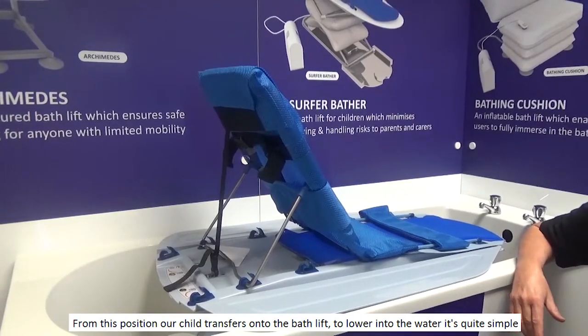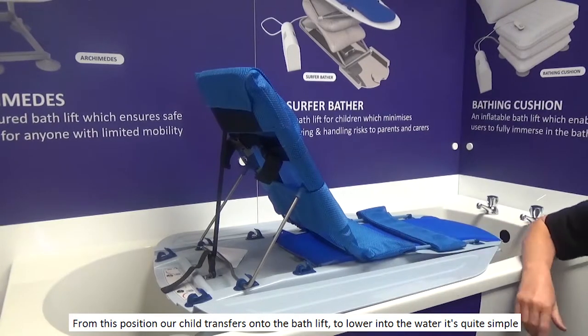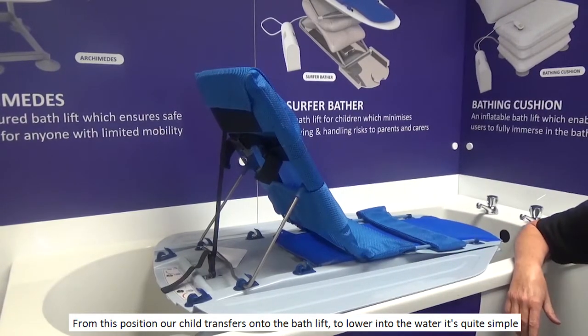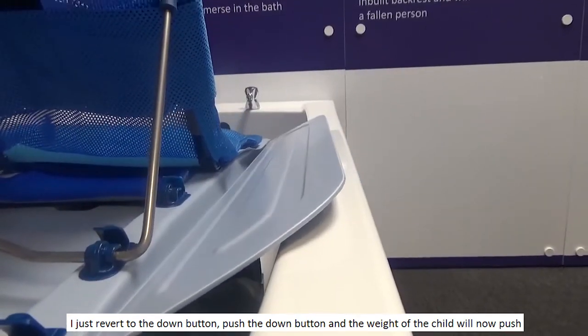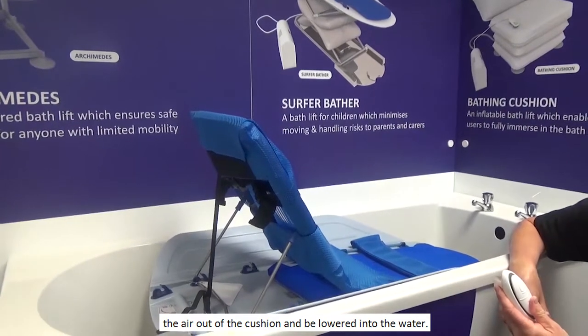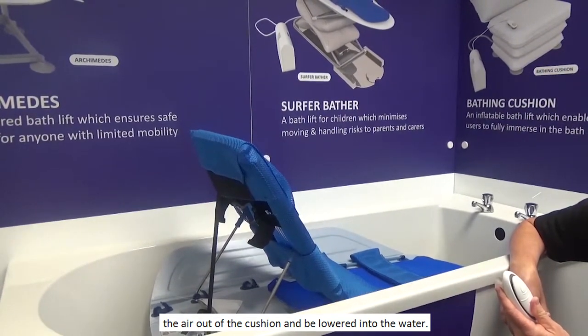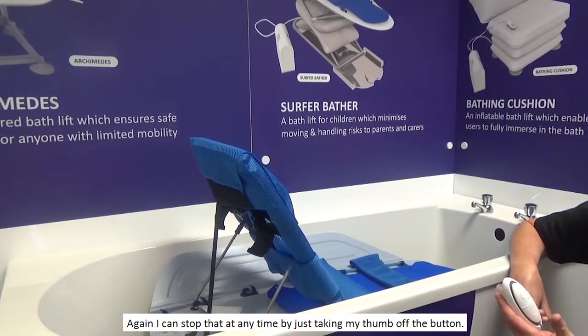From this position, the child transfers onto the bath lift. To lower into the water is quite simple — just revert to the down button, push the down button, and the weight of the child will push the air out of the cushion and we lower it into the water. I can stop that at any time by just taking my thumb off the button.